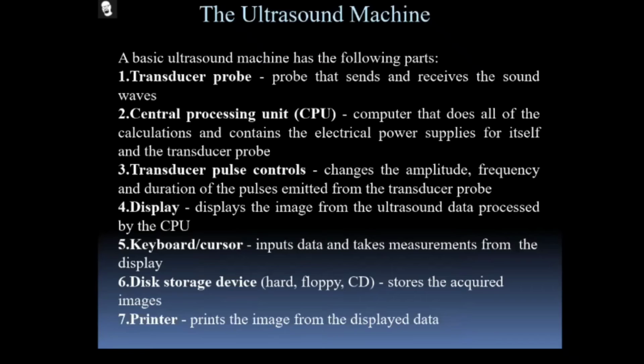And then this basic ultrasound machine has the following parts. The transducer probe, that I already told you about, has the capability of sending the ultrasound and receiving the ultrasound. That is the probe that sends and receives the sound waves.